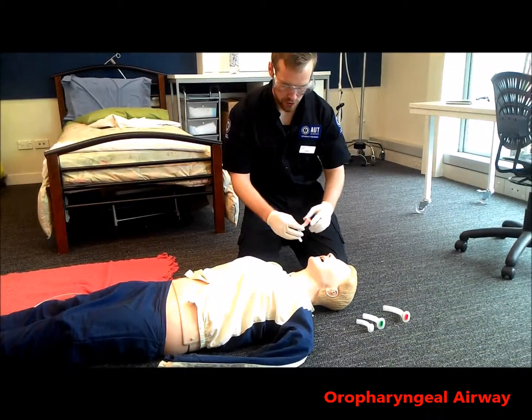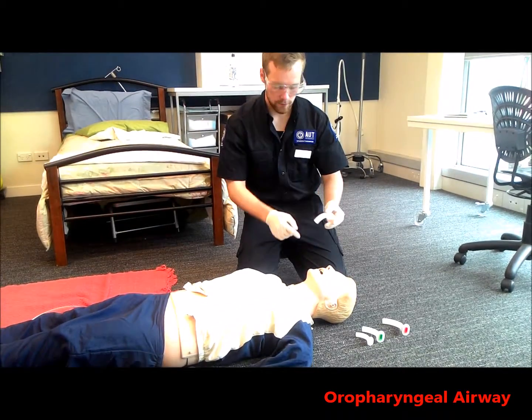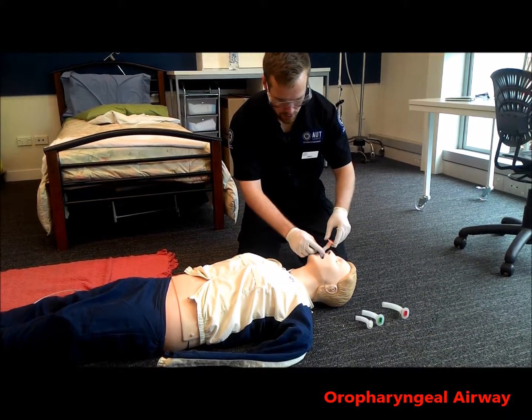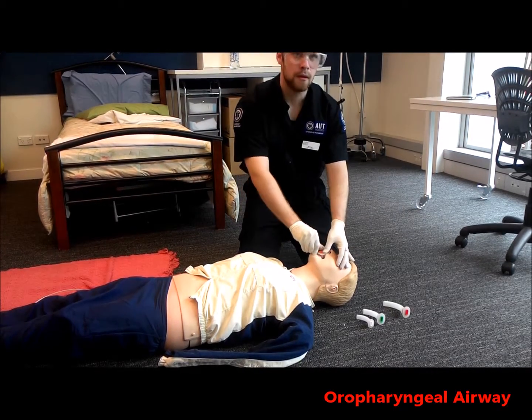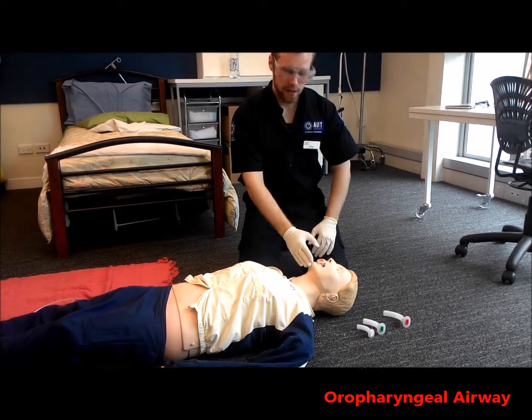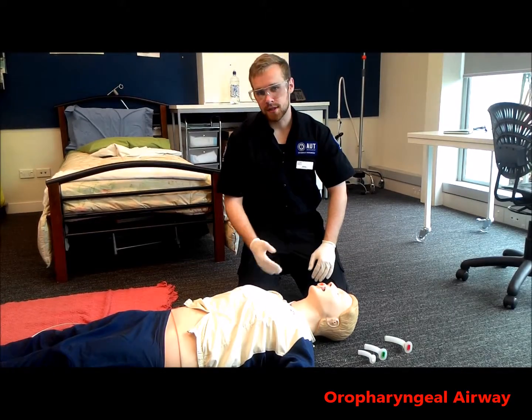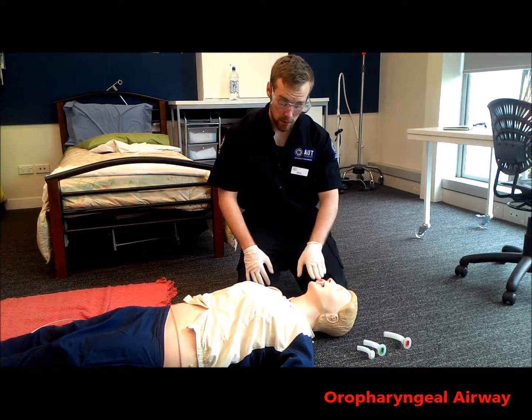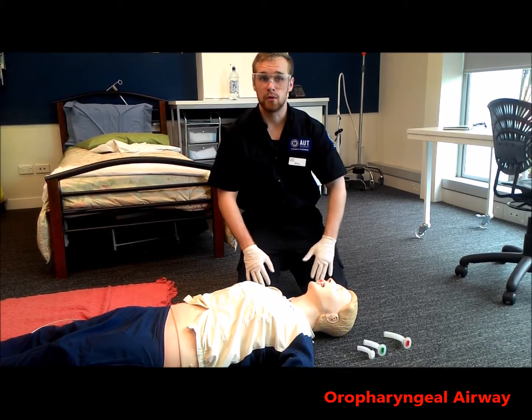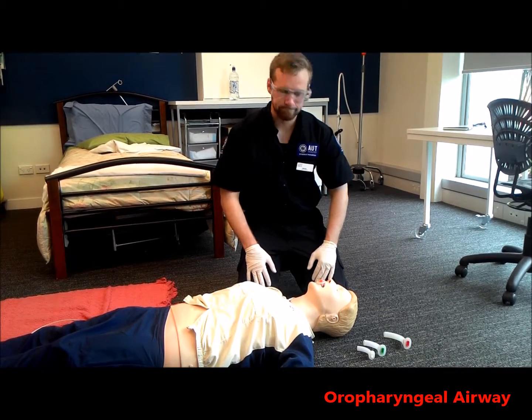So for inserting this, we want to have the curvature facing the roof of the mouth, and as we push it in, we want to rotate 180 degrees, and it will just slot right in there. So we want to avoid catching the tongue, and then we assess if the patient accepts the OPA. We can tell this by if the OPA starts inducing vomiting or damages and obstructs the airway.